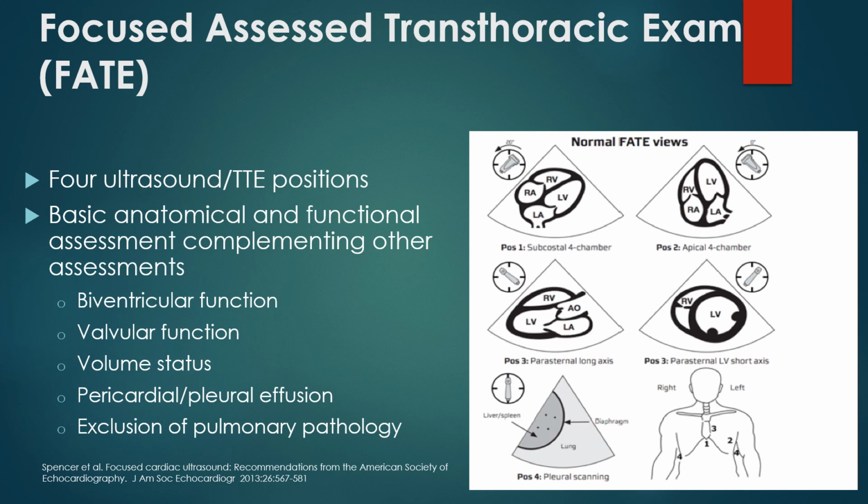So what is the FATE exam? In the FATE, we're not trying to do 20 views. We're not trying to become cardiologists. We are trying to make some assessment of cardiopulmonary instability and ask some very distinct questions here. But there are 4 basic ultrasound or transthoracic echo positions.